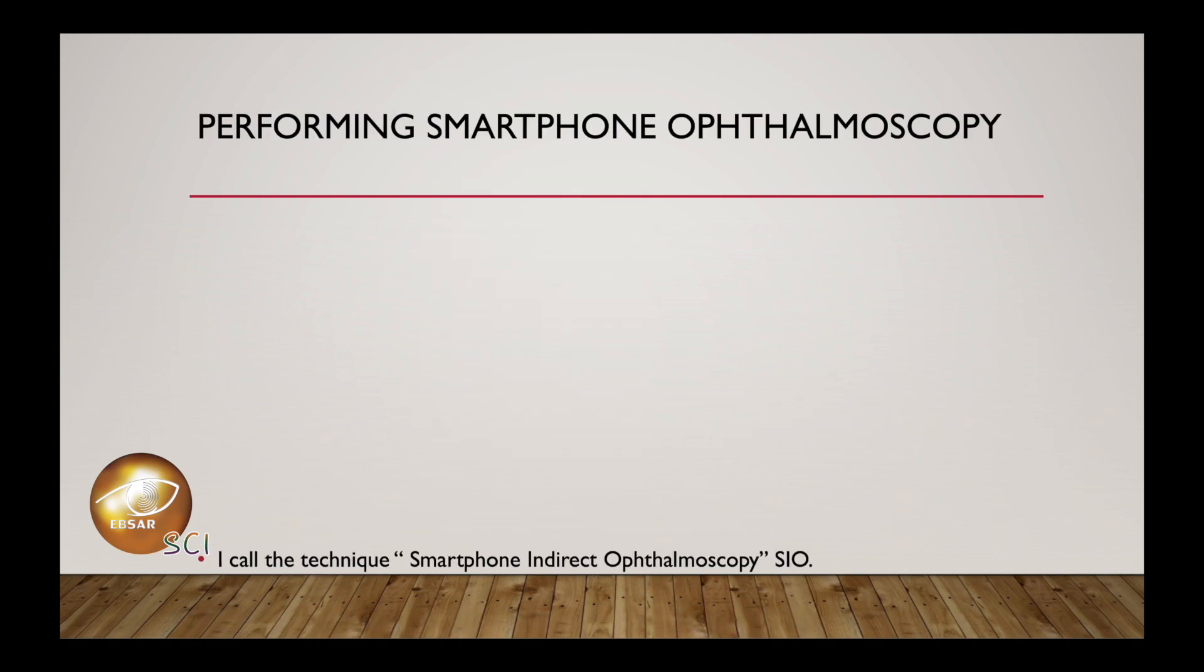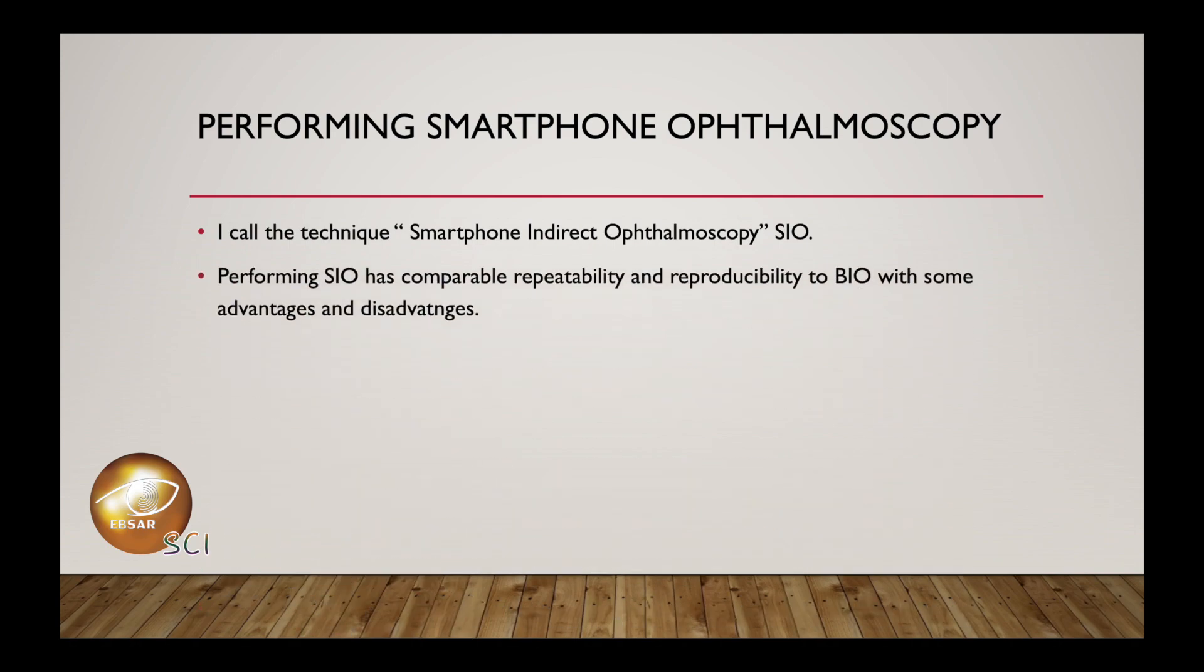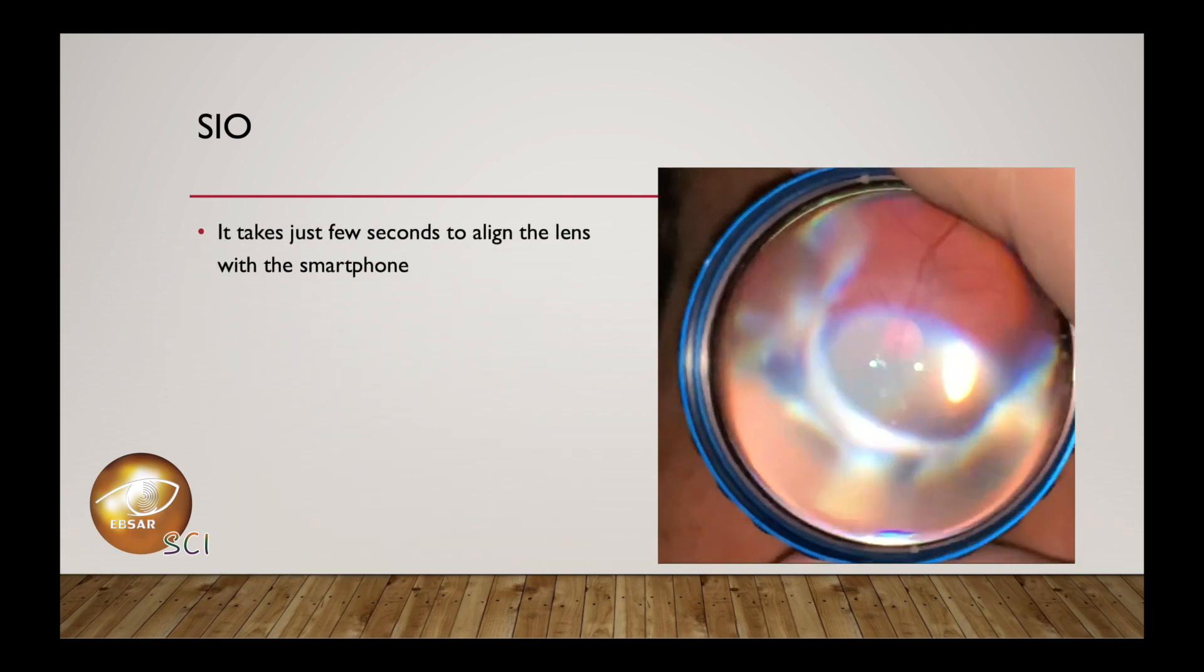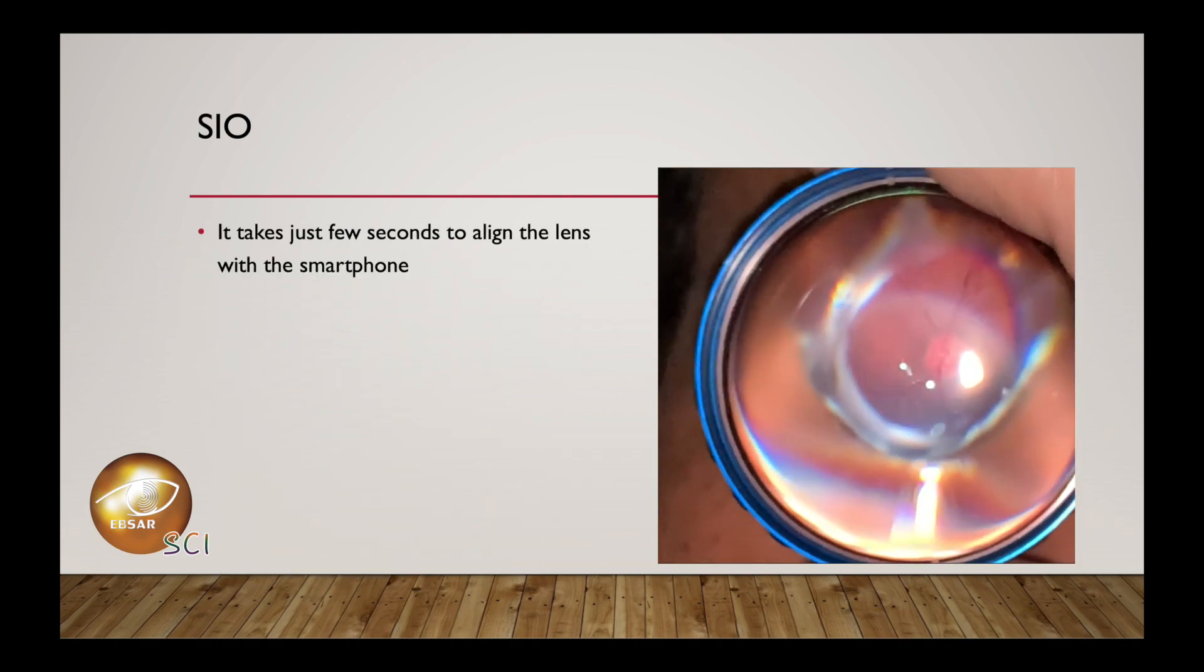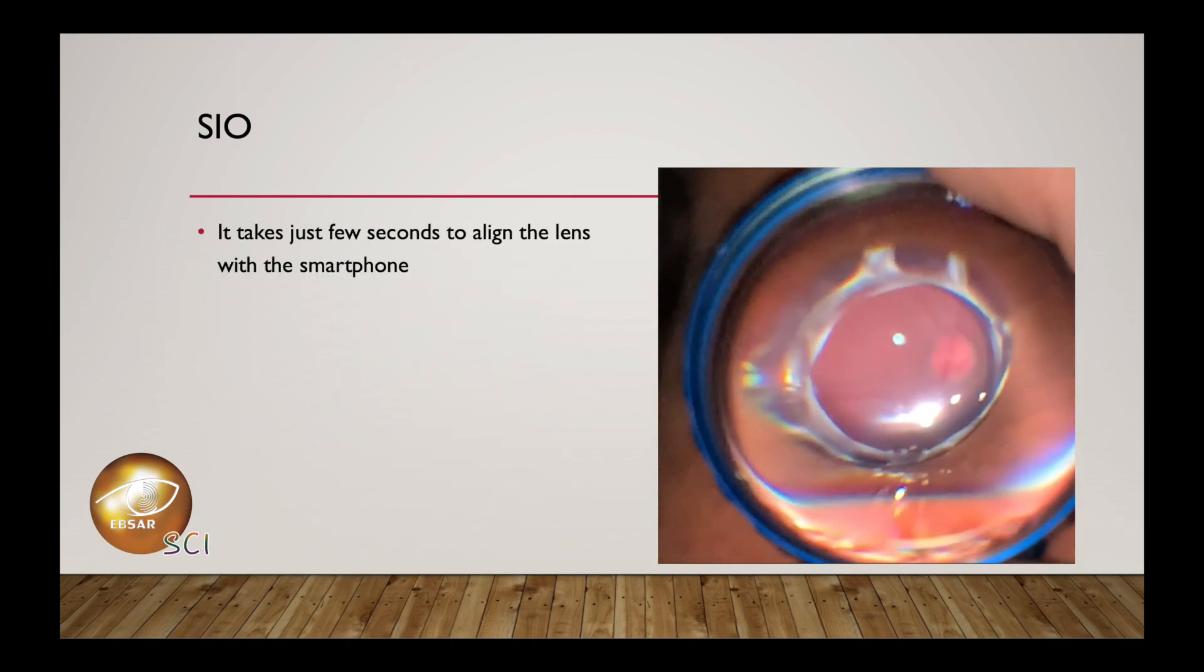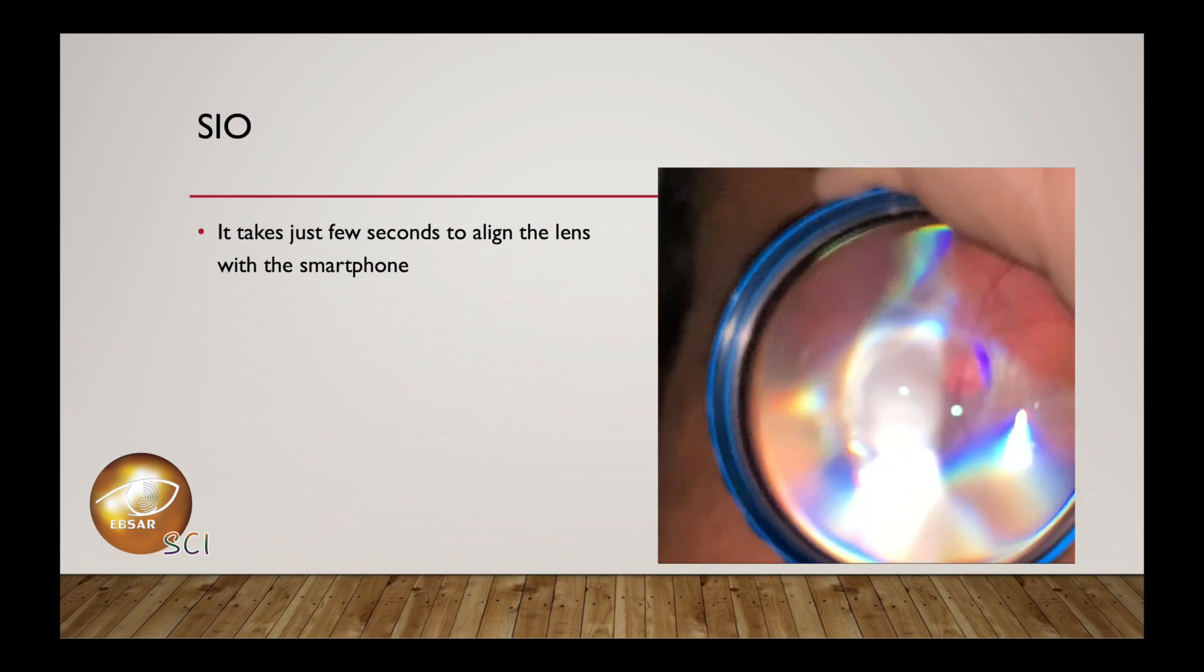I call this technique smartphone indirect ophthalmoscopy. Performing smartphone indirect ophthalmoscopy has comparable reliability and reproducibility to binocular indirect ophthalmoscopy with some advantages and disadvantages. It takes just a few seconds to align the lens with the smartphone. Once they are aligned with the proper distance apart, a clear image is visible.